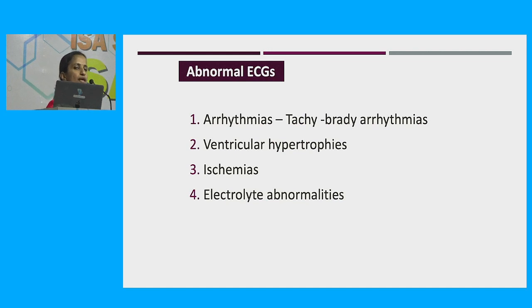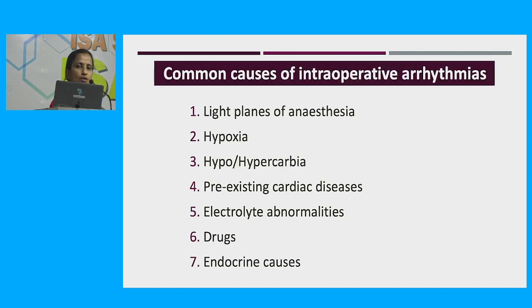So the usual abnormal ECGs asked in exams include arrhythmias, both tachy and bradyarrhythmias, ventricular hypertrophies, ischemias, electrolyte abnormalities, and so on. And the common causes of intraoperative arrhythmias include, all will be knowing.